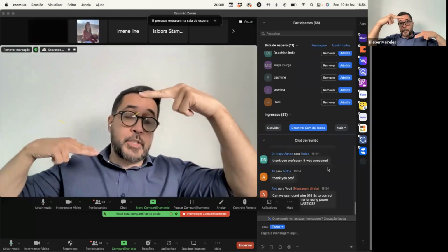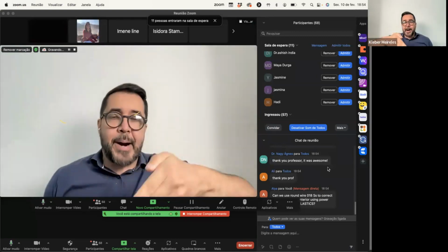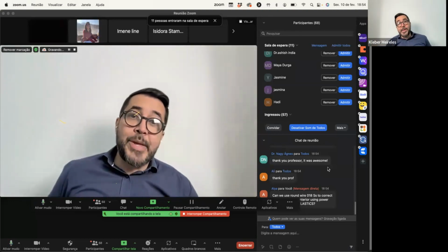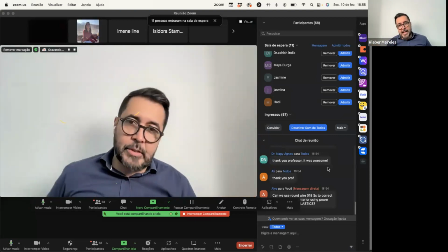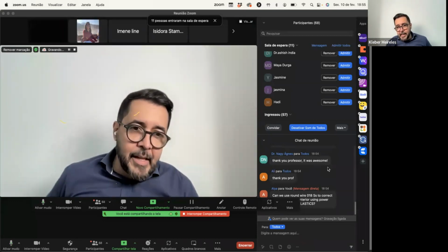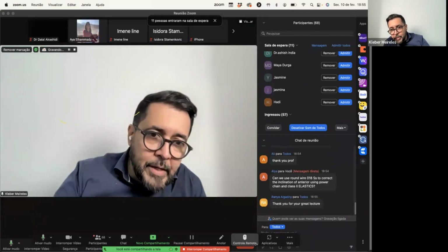You have just 2 points, and you are applying in one of those points close to the margin, where you are cutting your aligner, so it's weaker. So you don't have enough force at that part. So I don't like to do that. I think it's worthless. I think it's nothing that you can control. Okay, let's move to another question.